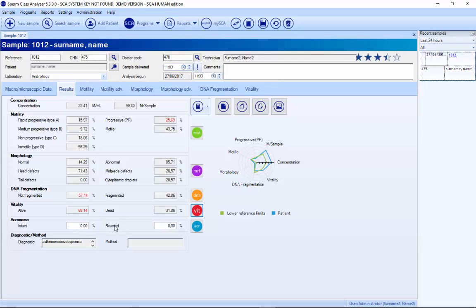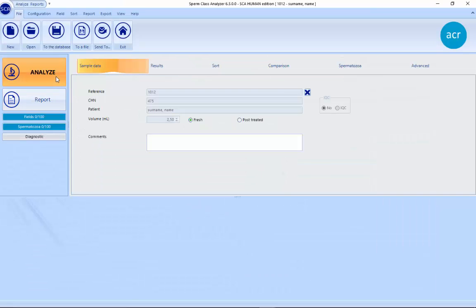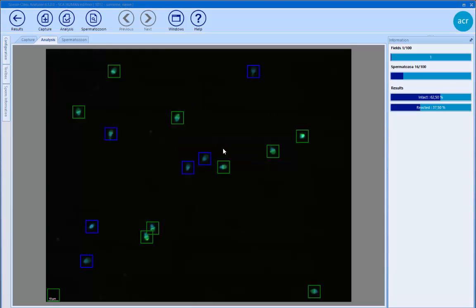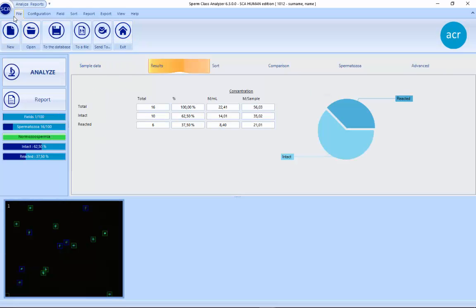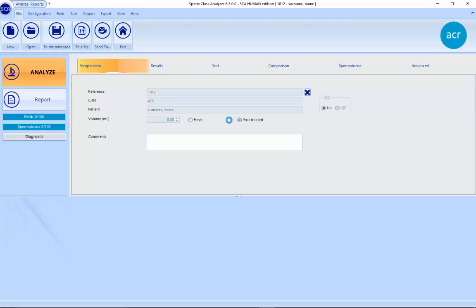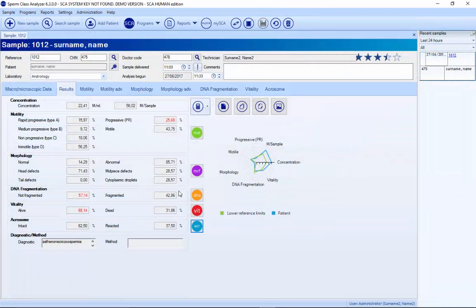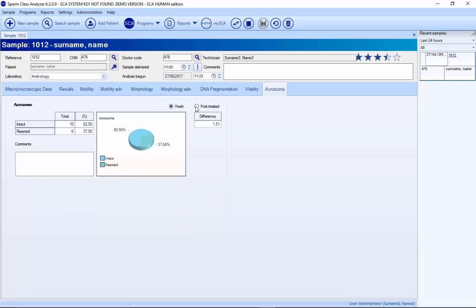Finally, the last analysis is the acrosome reaction. For this module we use the FluAcro kit. If it's blue, it means the sperm has reacted. You capture the control sample fields, then add calcium ionophore and analyze the sample again. The system compares before and after calcium, and when you exit you have all the different parameters: the fresh analysis, the analysis with calcium, the percentages, and the difference between both.